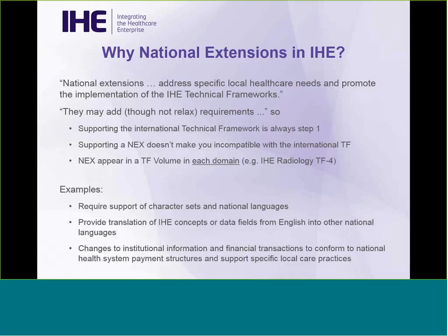Something to keep in mind is that these will add requirements, but they will typically not relax requirements. The corollary is that supporting the technical framework, supporting the base profile, is always step one for implementers. First thing you do is implement the profile, and then if you're selling within a particular national region, go look at the national extensions to see if there are a few additional requirements.